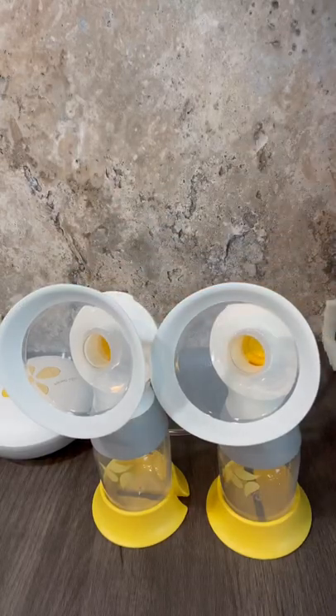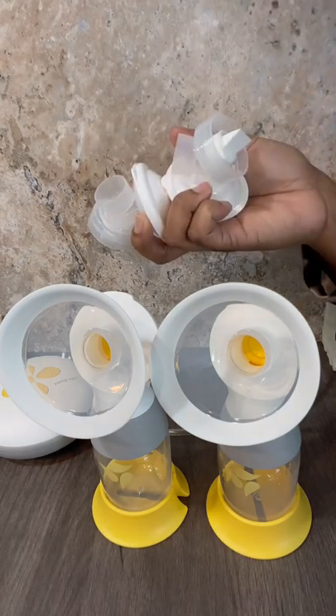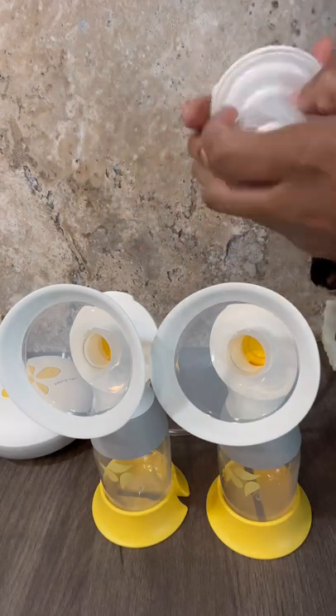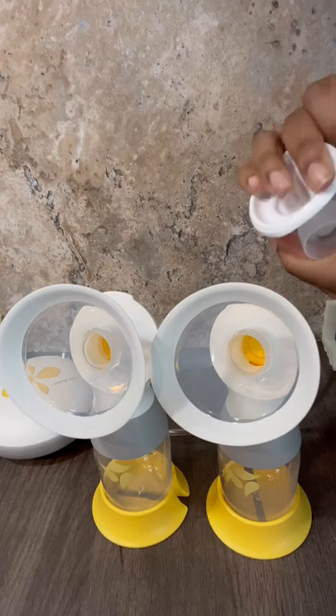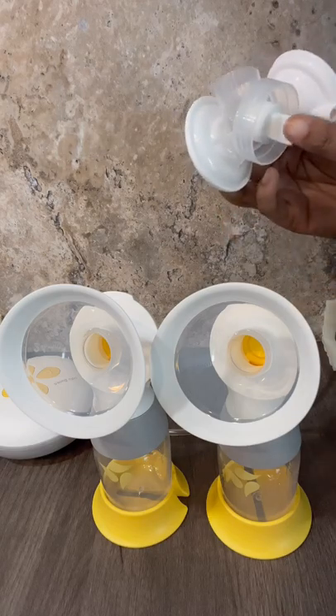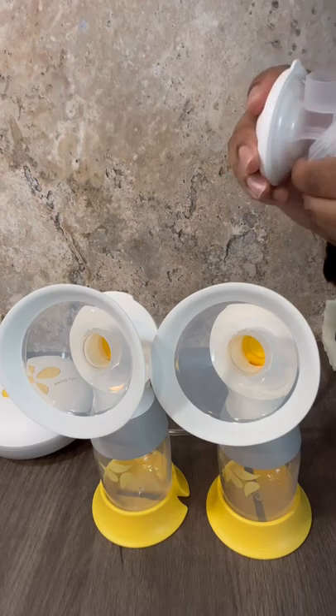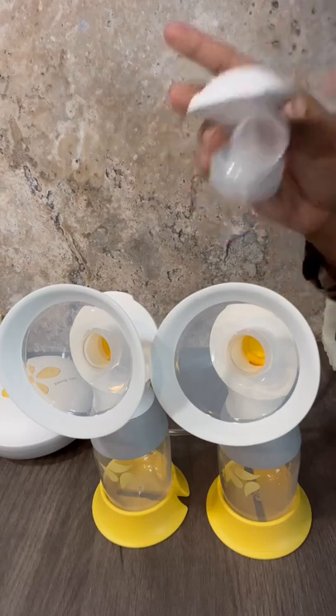Tired of having to replace this entire part in order to continue your pumping journey? Well, I have the ultimate hack for you. This product can be found in my Amazon storefront. It has a normal duckbill, it has a backflow protector, and it's half the cost.